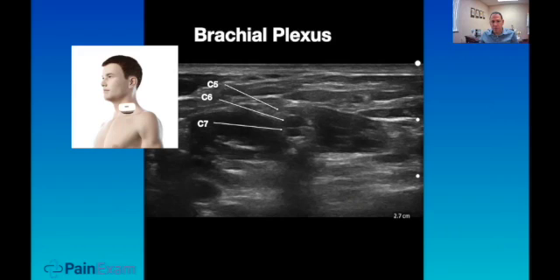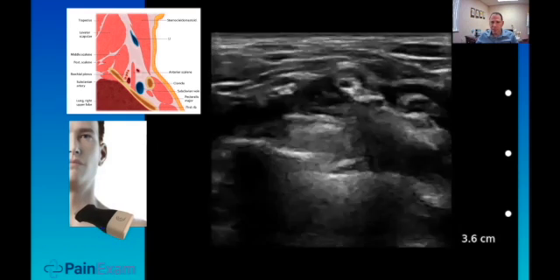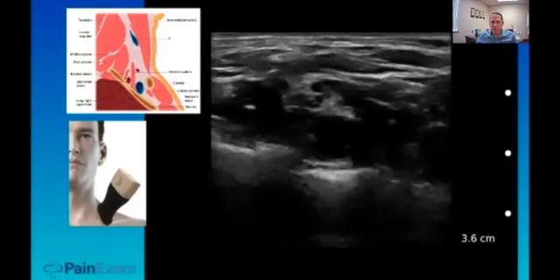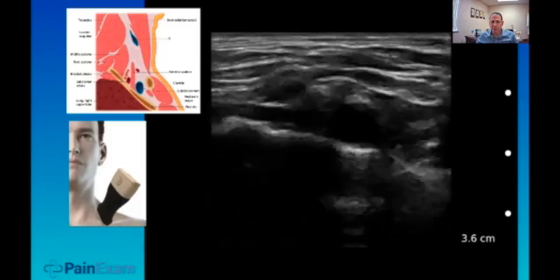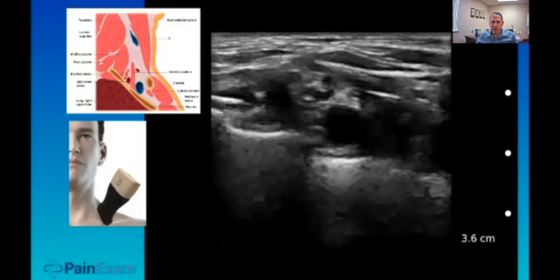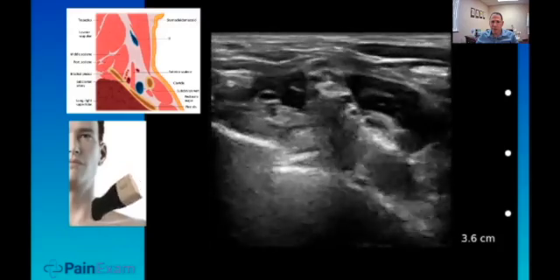Here's a picture of the interscalene brachial plexus. C5 is usually the most superficial, then C6 and C7. Here's an image of scanning to find it. We're in the neck — watch the probe move as we scan downwards towards the supraclavicular brachial plexus region. You'll see how the nerves appear above the vessel, and how they change in appearance as we go back up the neck towards the interscalene fossa.